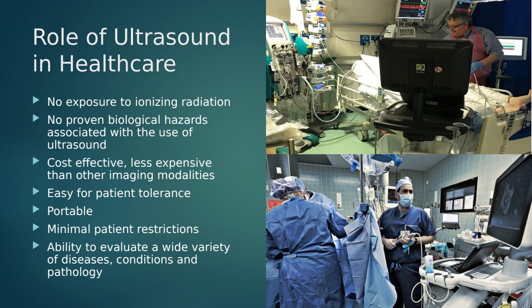We're not using radiation, so we don't have to worry about bringing ultrasound to the patient's bedside. We don't have to worry about using radiation with a pregnant woman, with a child, using it in the OR with everybody exposed to that radiation. We don't have any biologic hazards that have been researched with the use of ultrasound.